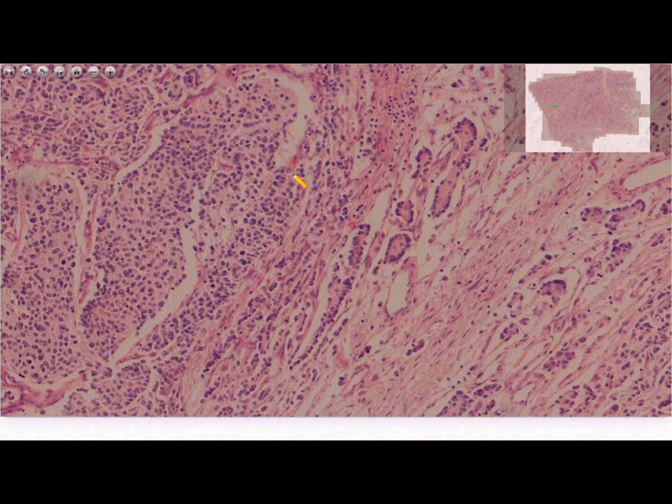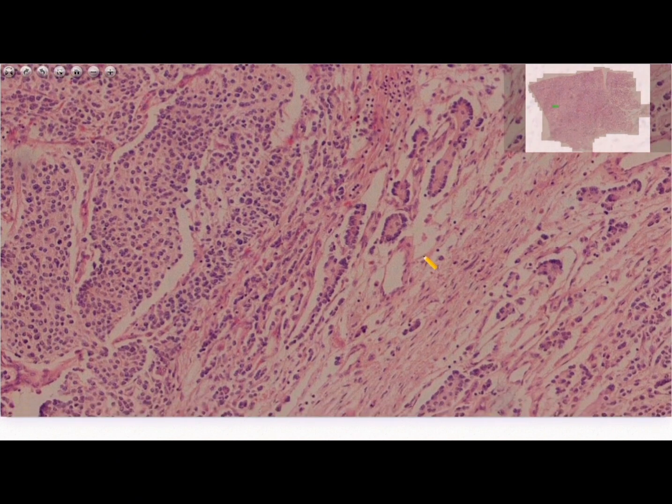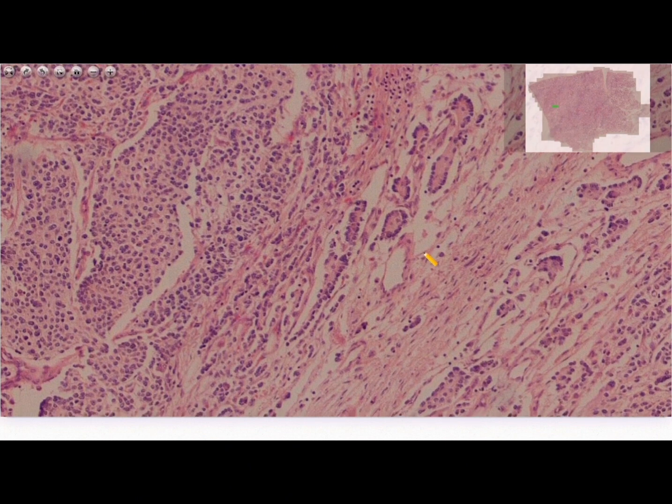You'll also notice that the nuclei are hyperchromatic, dark and dense. We also have high mitotic activity. We also have karyorrhexis in some cells, where the nucleus breaks into fragments. It's a difficult one to find under the microscope, so I don't recommend you look for it, but just know this point for your theory exams.